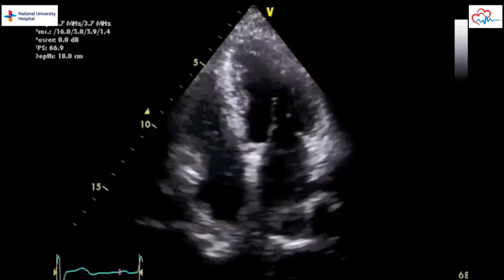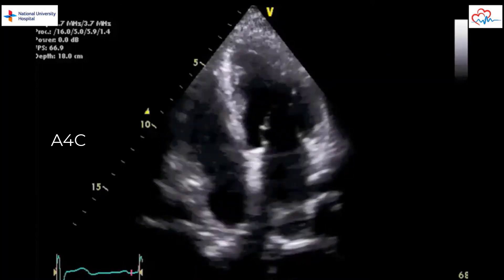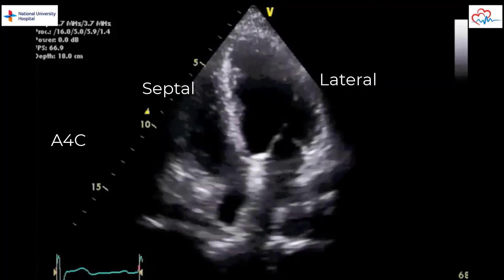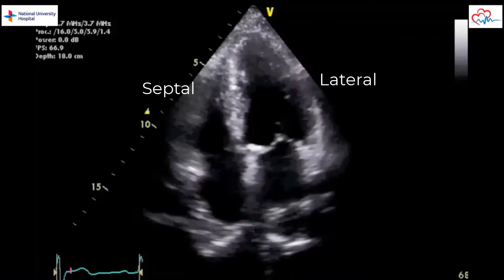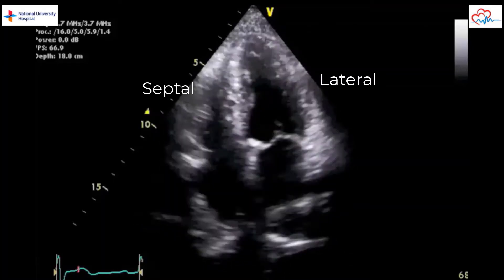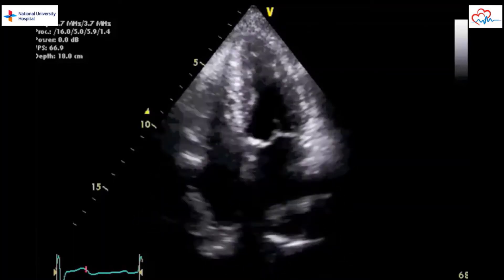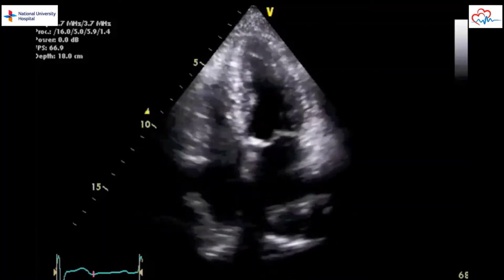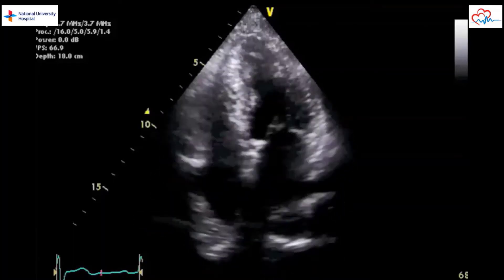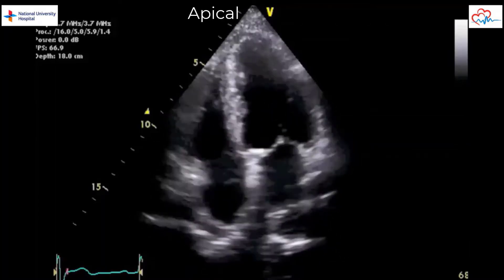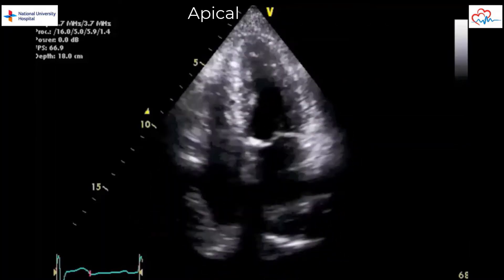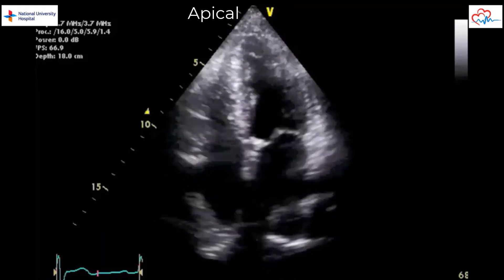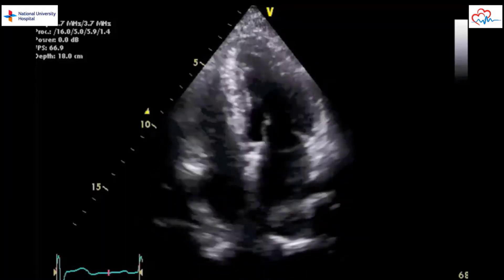In the apical four-chamber view, we have the LV septal and lateral walls. The lateral wall is supplied by the circumflex artery, whilst the septal wall is supplied by the RCA and LAD. The apical cap is supplied by the LAD. LV systolic function is normal here, and there is no RWMA.